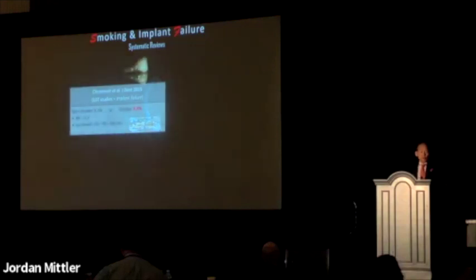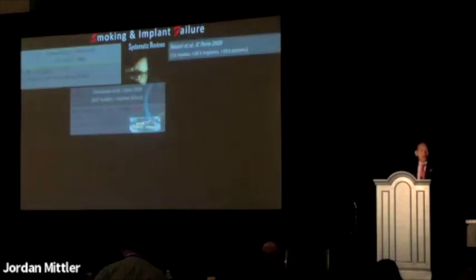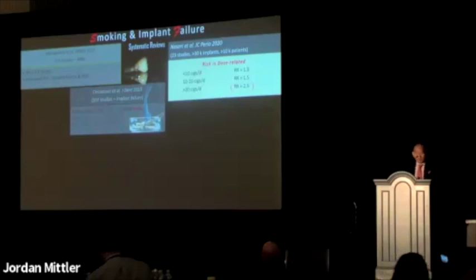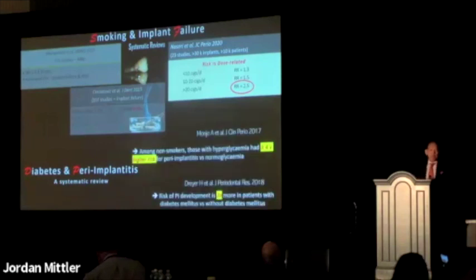And of course, we know smoking is a problem, and it's not just smoking, it's how much you smoke. So for some of these patients, is there an implant or design that we can use to address them? The risk factor is really more than 10 cigarettes. If you smoke less than 10 cigarettes, the risk ratio is about 1.3, which is essentially minimal risk. 1 is no risk. So 5 to 10 cigarettes, they're going to do okay. But from 10 to 20, the risk ratio goes to 1.5, and a pack a day is 2.5 times the risk. Same thing with diabetes: having high sugar is 3 to 3.5 times more risk of developing disease.